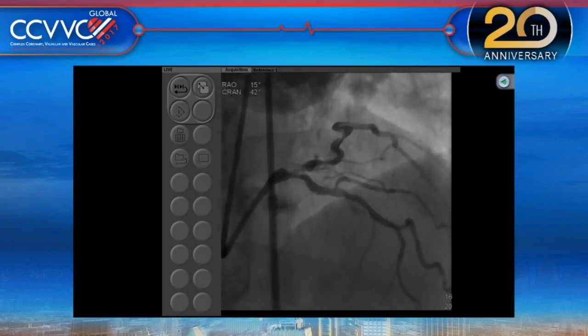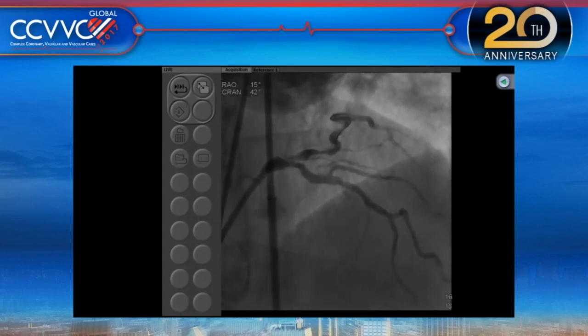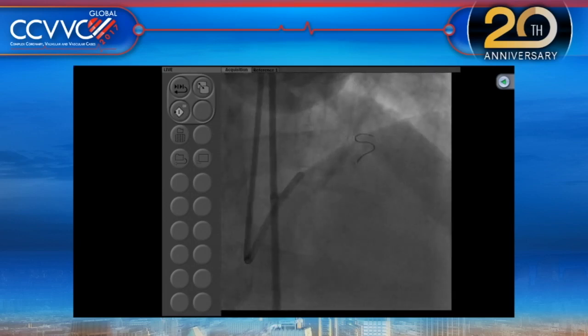I think the angioscope might take care of the ostium, no? Much better. Yeah, I might do an IFR of the LAD. It's hard to tell because there's a series of lesions, but even after the second diag, there's a lesion. No, we are just talking about the level of the left main. We are not going to go further down after the diagonals, so we just concentrate on that level.